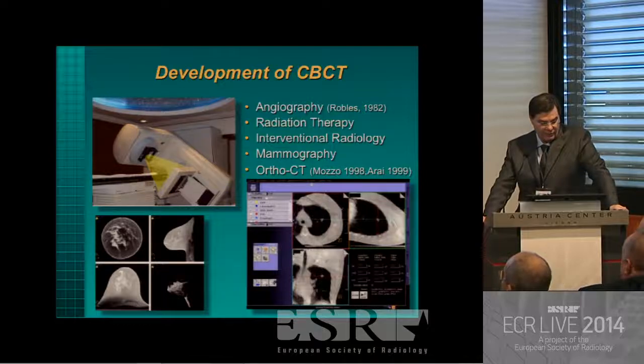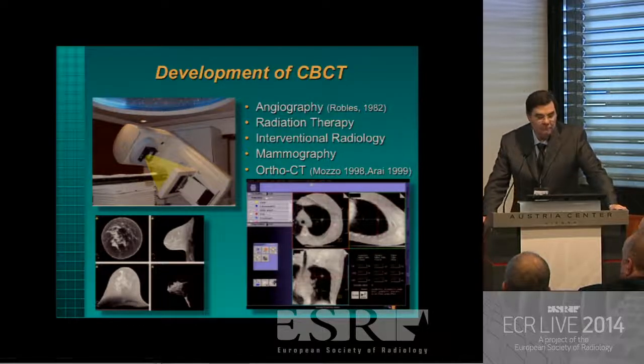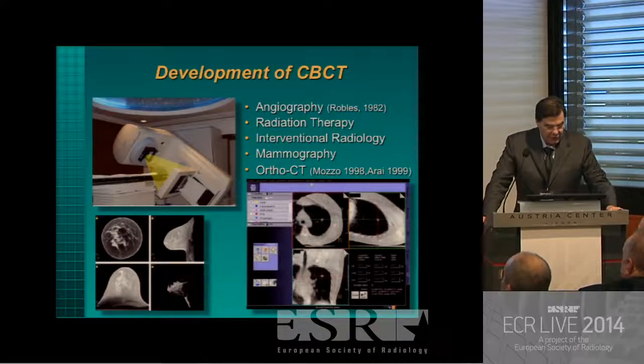also at our department. The next step was cone beam CT, as described earlier, with the first publications in 1982 in the field of angiography.